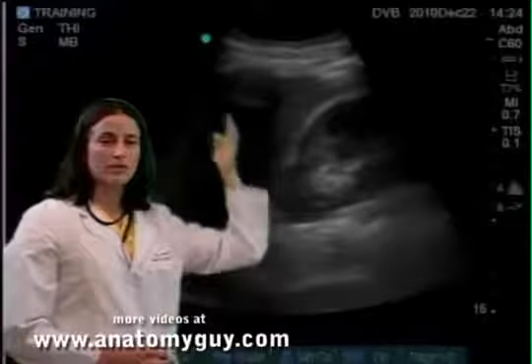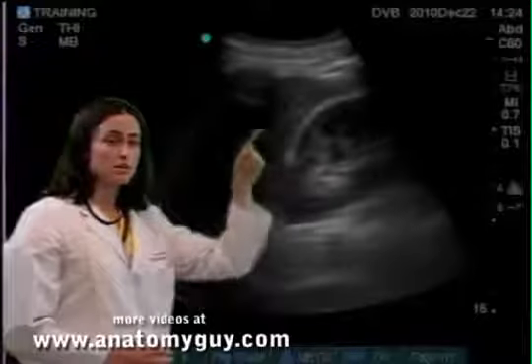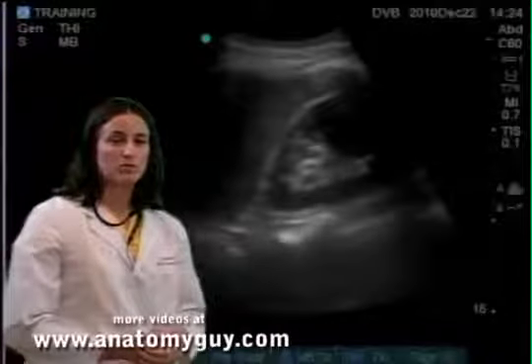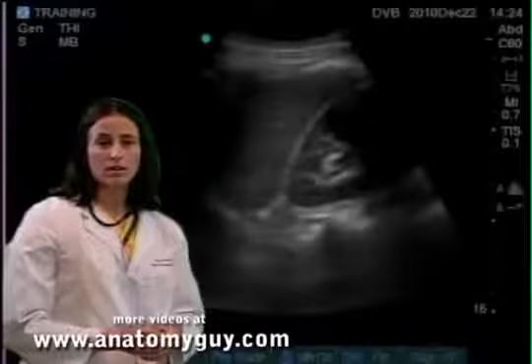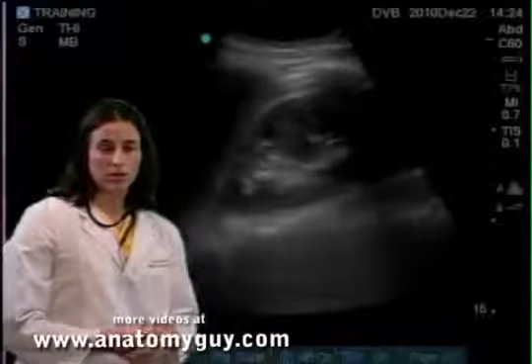So we have here liver behind me and then kidney. There is no black hypoechoic stripe between the liver and kidney along this line, indicating that there's no fluid present. Sometimes rib shadowing can obscure your view between the kidney and the liver, so we have the patient take a deep breath in and breathe out, so we can scan through and see the entire liver behind the rib shadowing.